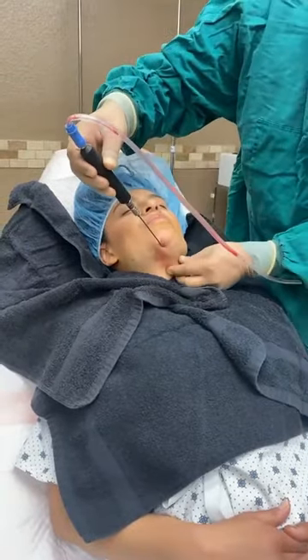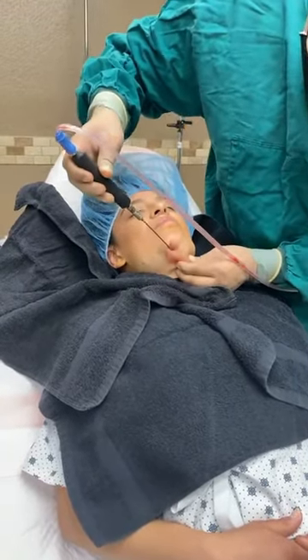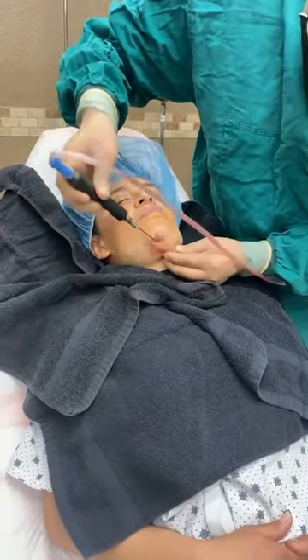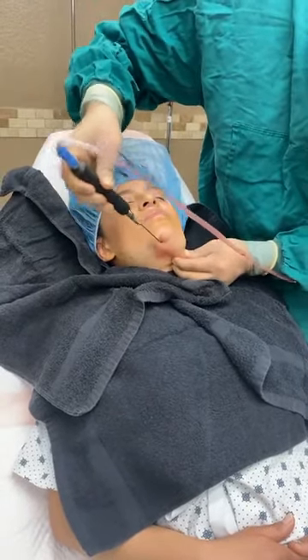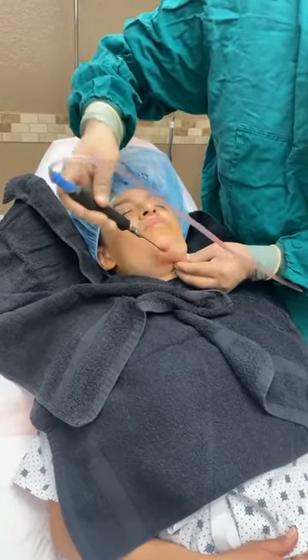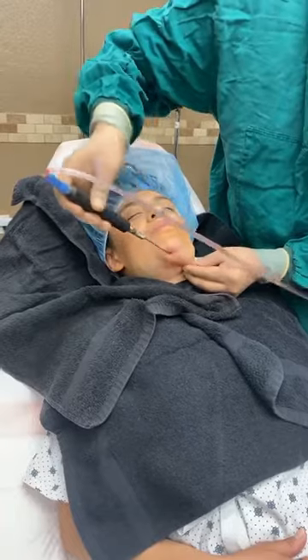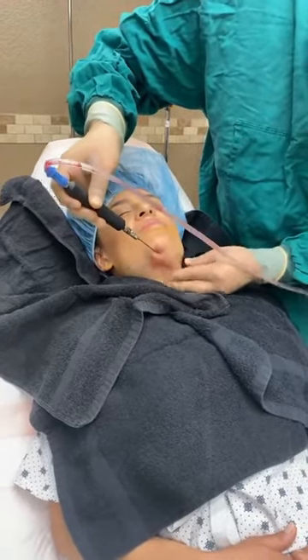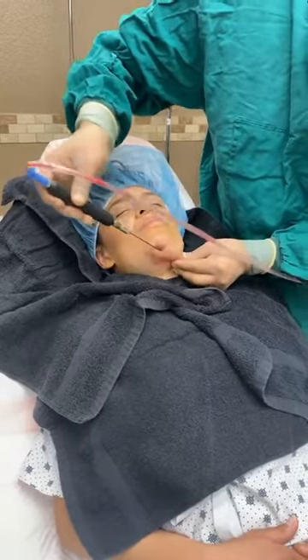I'm just going to grab a little bit more over here because, again, the appearance may make you think that it's all in the middle, but in reality, it may be just off to the side. So we want to get this as well. And I can assure you that it's less than 10 cc's of fat.